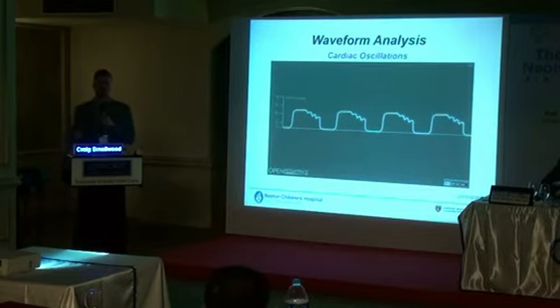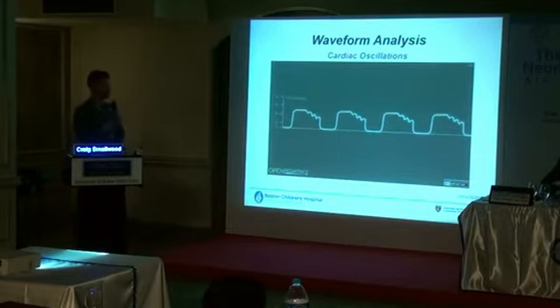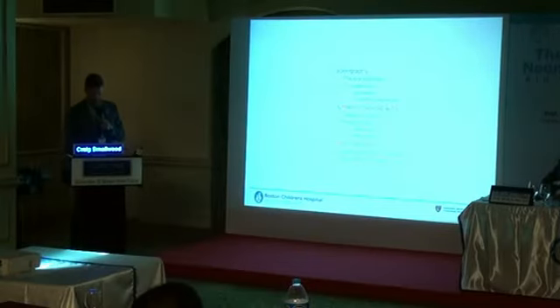And I told you that the first handful of times that I saw this, I was really anxious and I didn't know what to think of it. I thought it was going to be a dreadful finding for my patient. Well, it turns out this doesn't really matter that much. It's not a big deal in most cases, so long as you have adequate ventilation and no other clinical problems with the patient. If you see this, just don't get worried. And that's basically the summary of that.